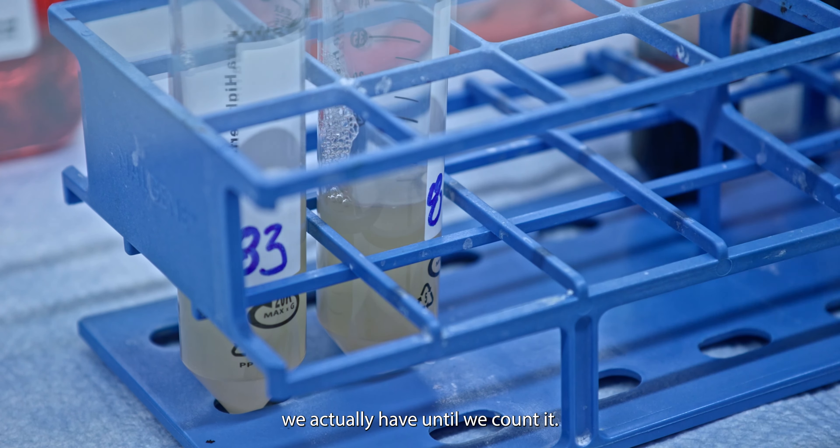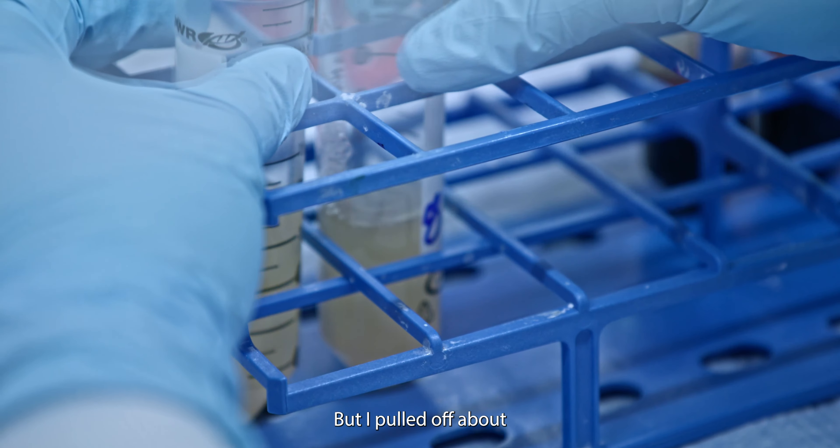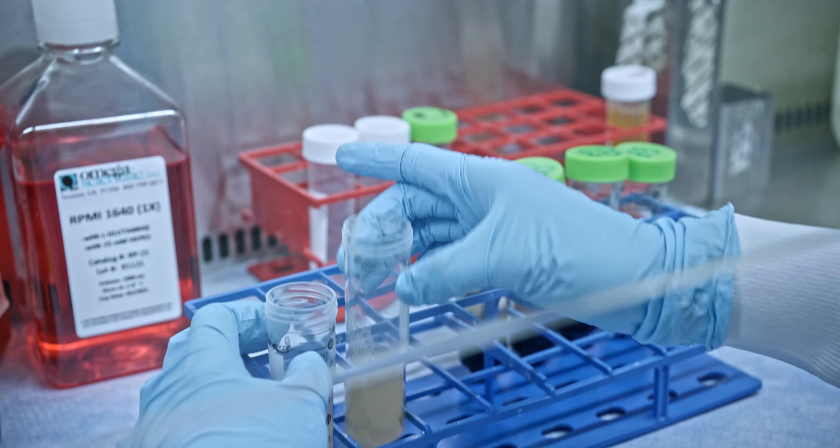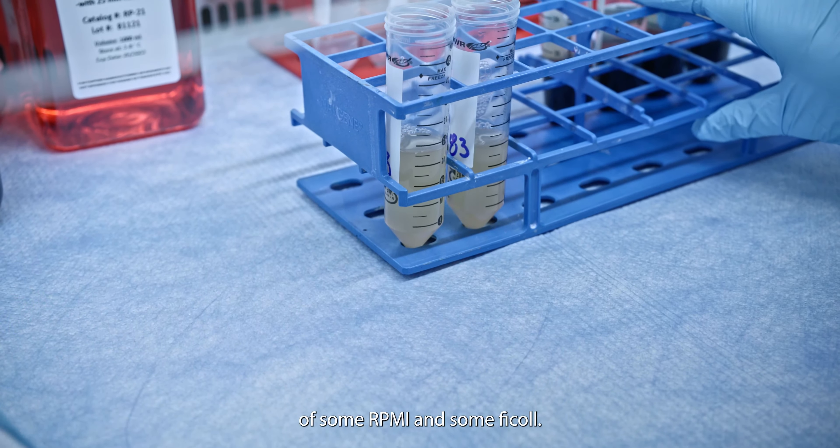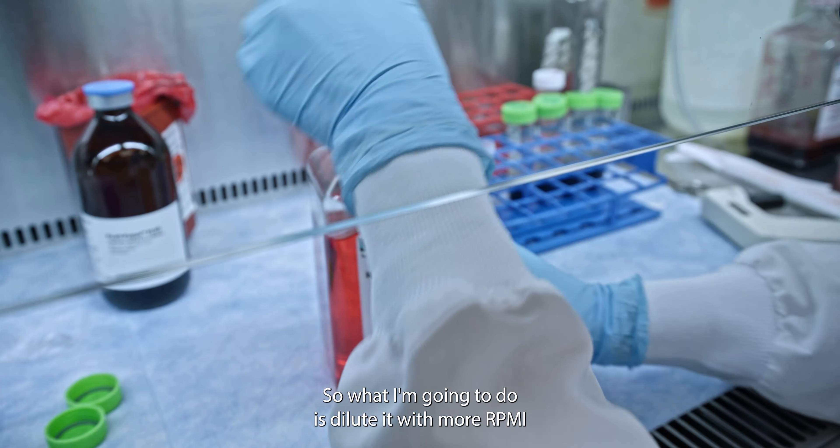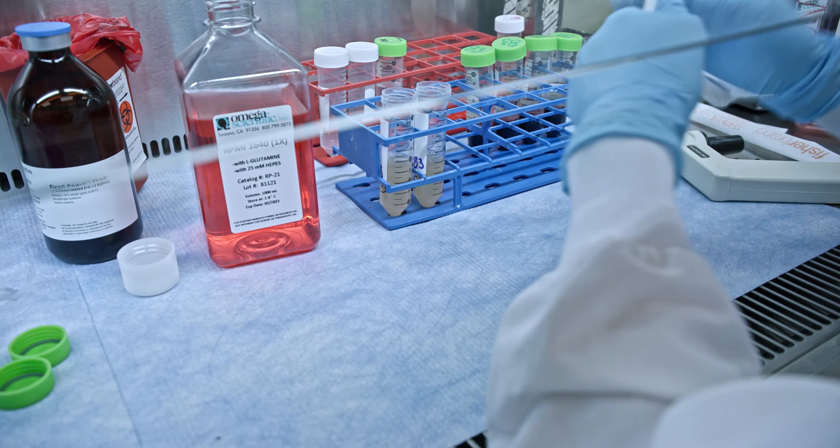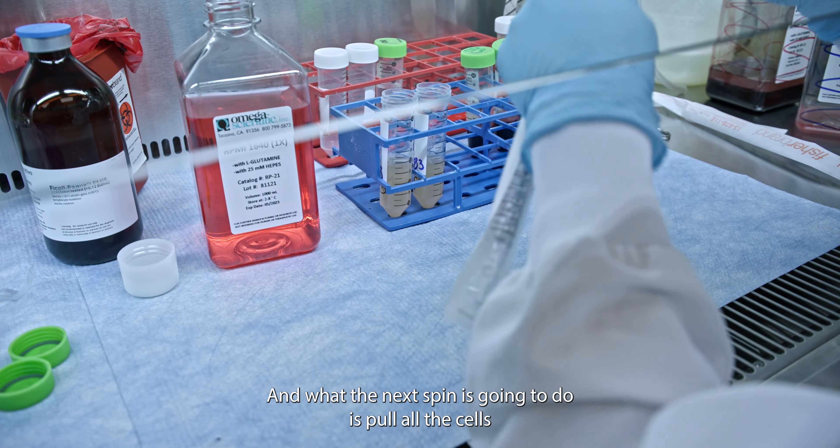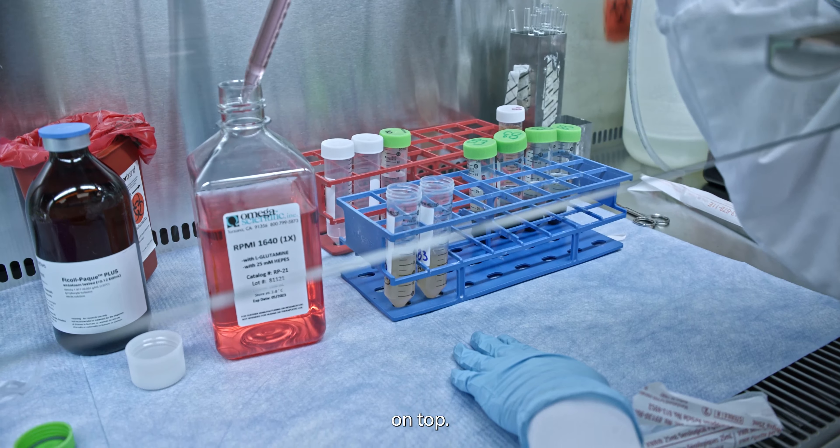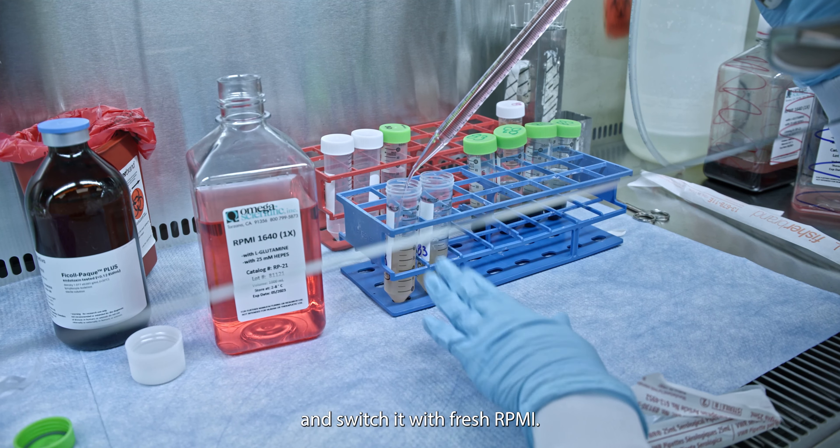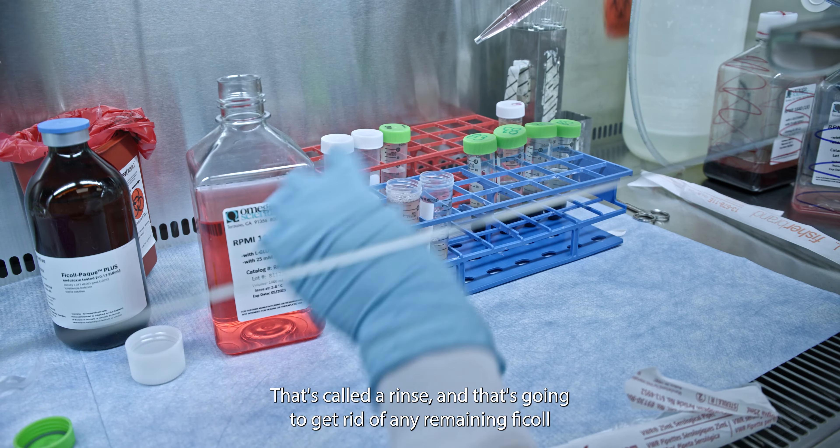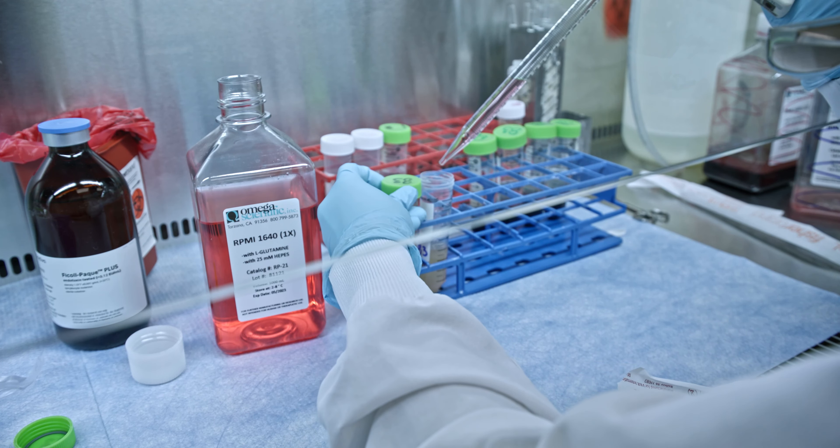We won't know how many cells we actually have until we count it, but I've pulled off about 45 ml in total, but that is still a mixture of some RPMI and some Ficoll. So what I'm going to do is dilute it with more RPMI, and what the next spin is going to do is pull all the cells down to the bottom of the tube and leave the media on top, and we're going to pour off that media and switch it with fresh RPMI. So that's called a rinse, and that's going to get rid of any remaining Ficoll in these tubes.